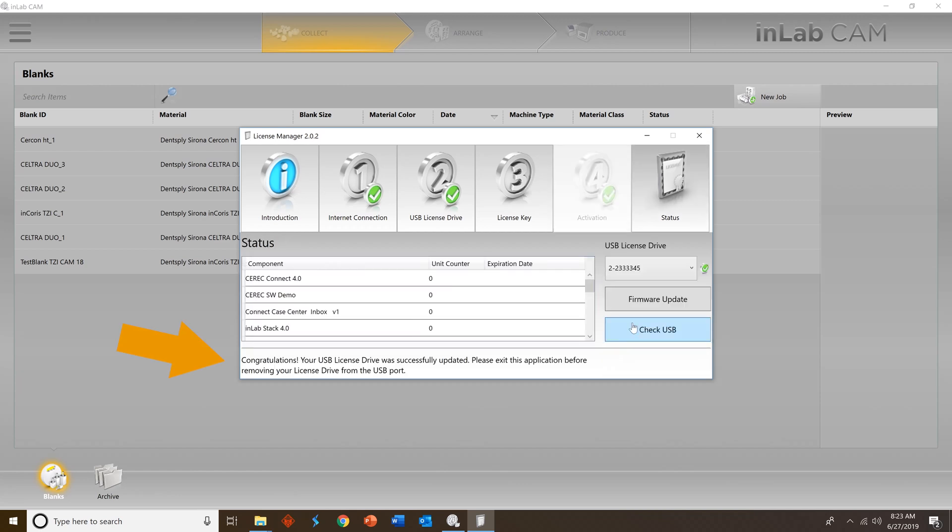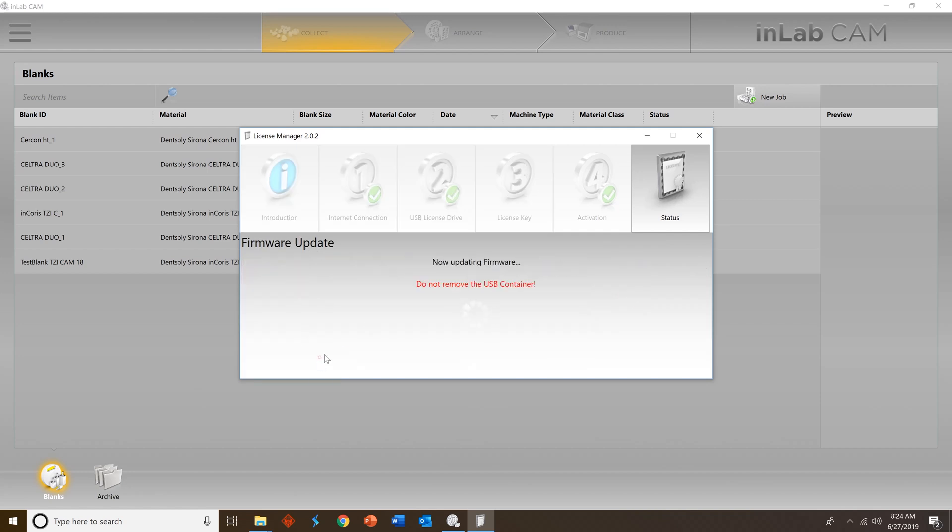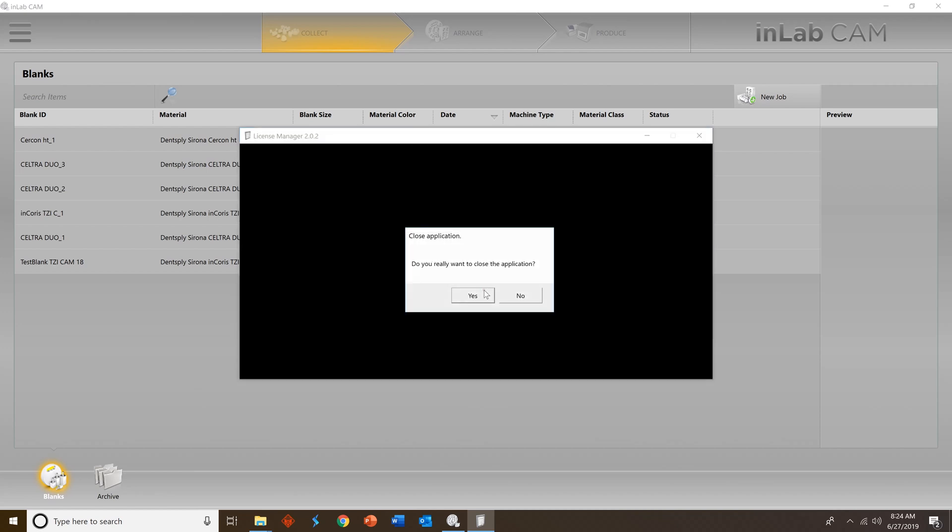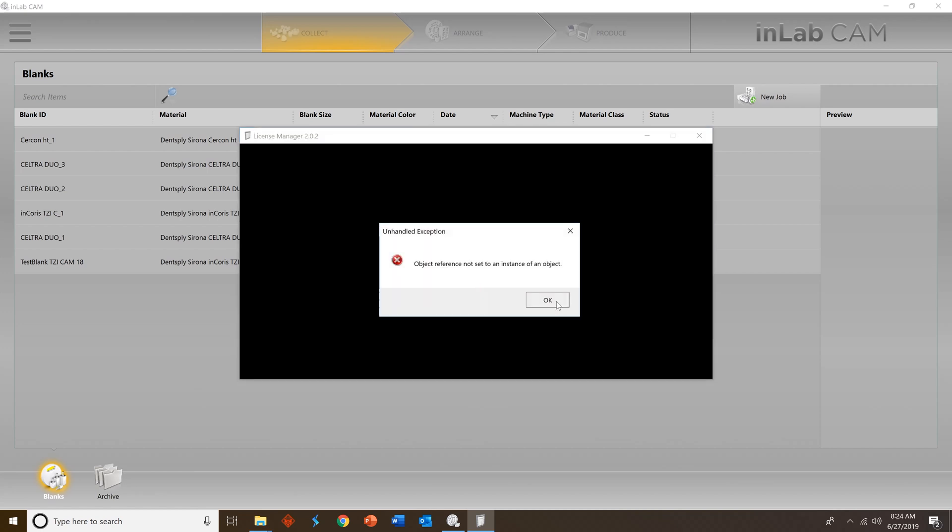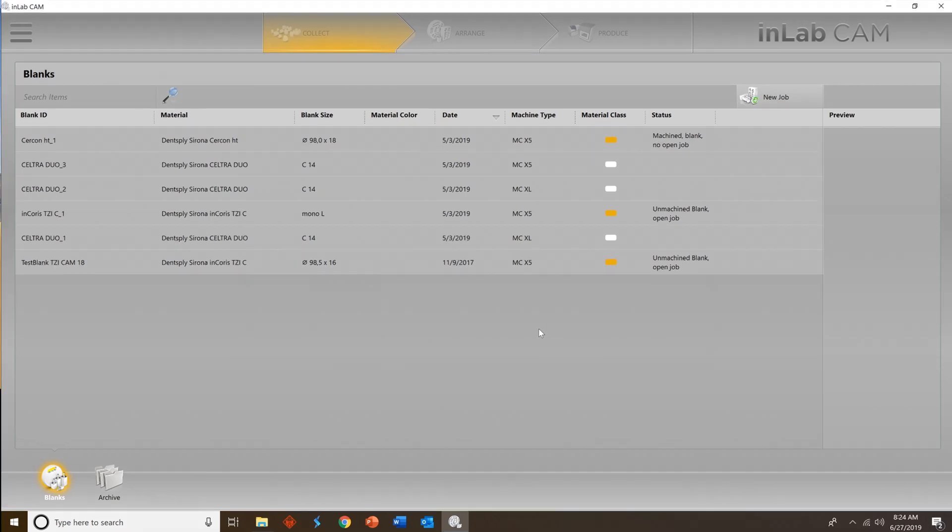Go ahead and check your firmware on your USB at this time. Update it. Press continue. Once that's done, you're good to go. You'll go up, close your license manager in the top right corner and you're ready to enjoy InLab CAM 19.